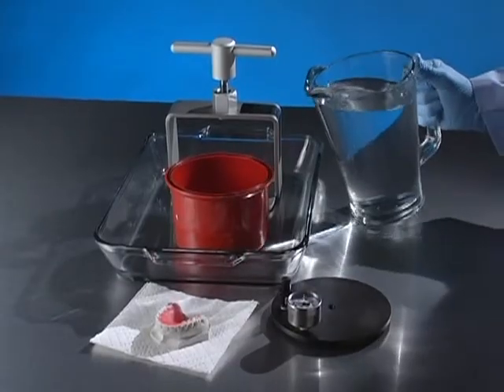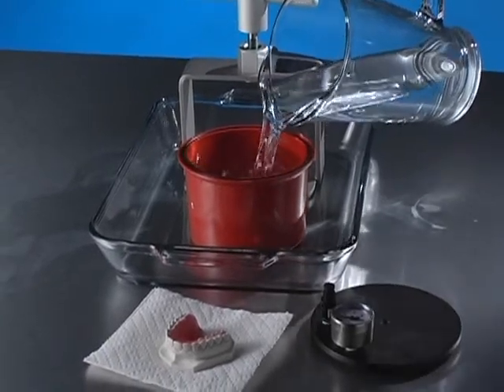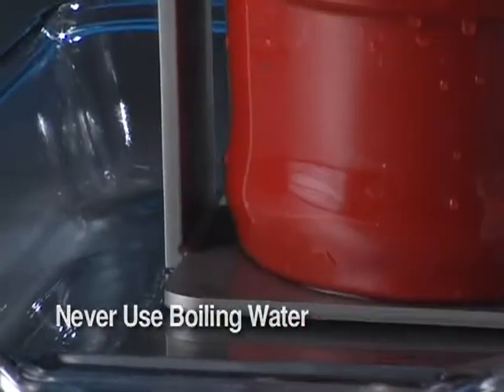Put the AquaPress into a sink or large dish to catch any water overflow. Fill the entire pot to overflowing so there will be no air when you close it. Use lukewarm water, not boiling, as it will permanently warp the bowl.